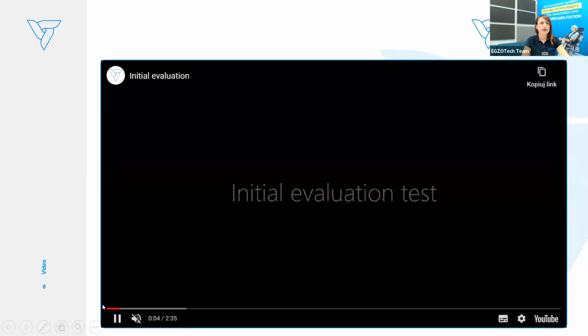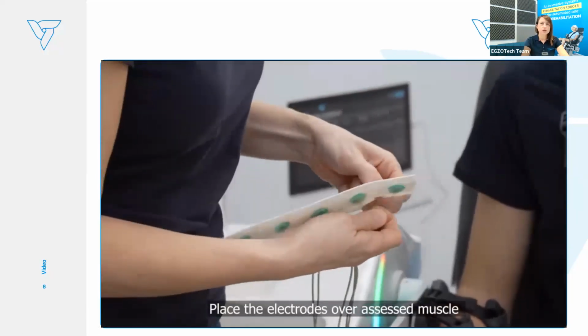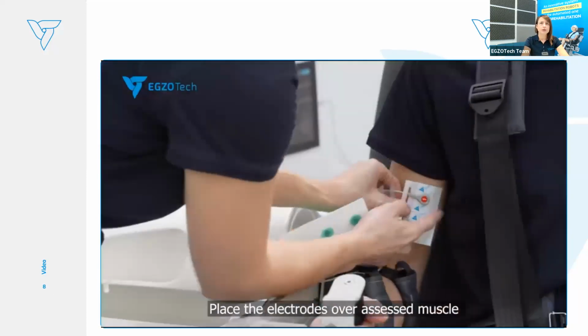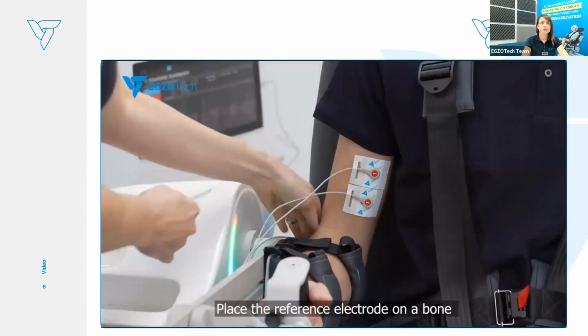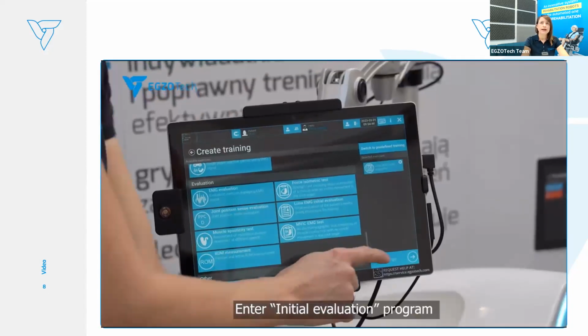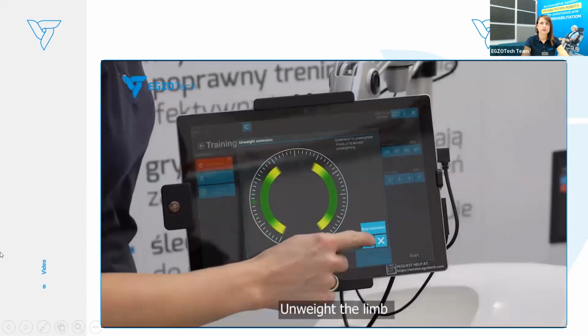So like I said, we have EMG that we can put on the muscle, and we can put it either on one muscle or on more muscles at the same time. It depends what we want to evaluate, but a minimum of 1 EMG channel has to be put there. We unweight the limb.